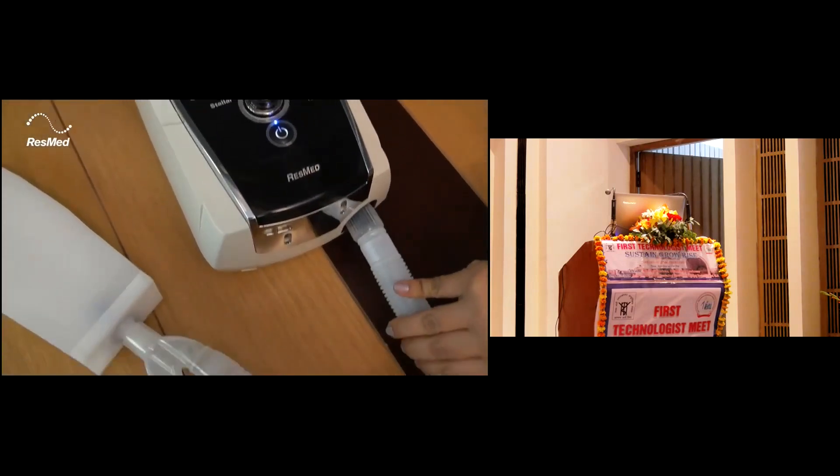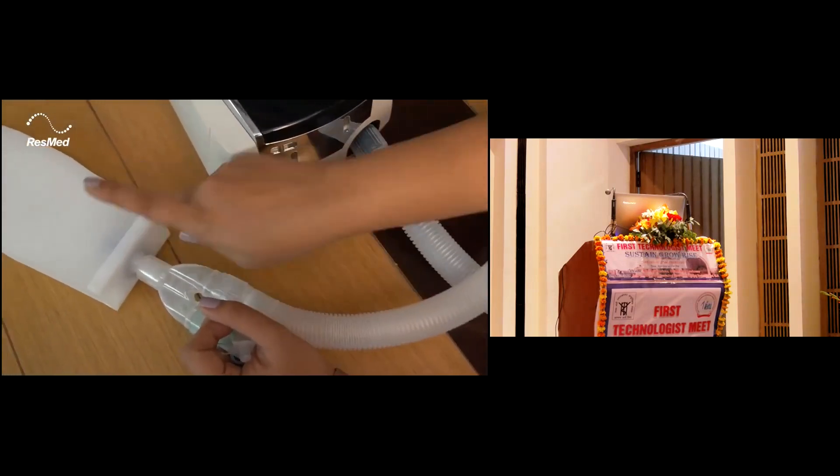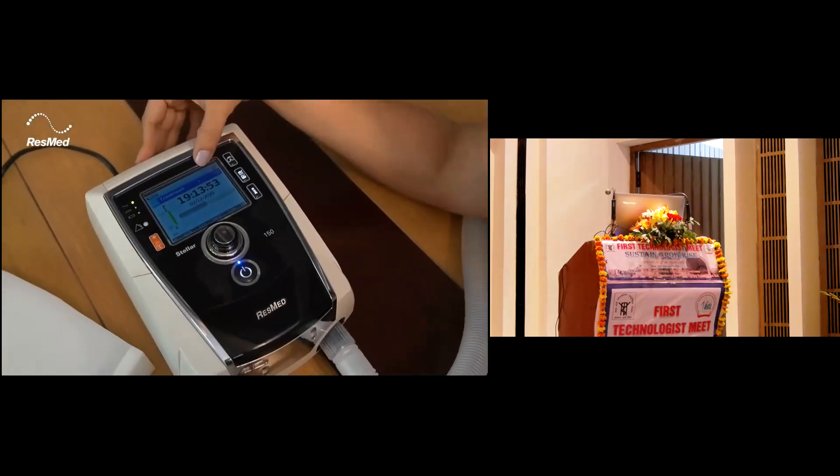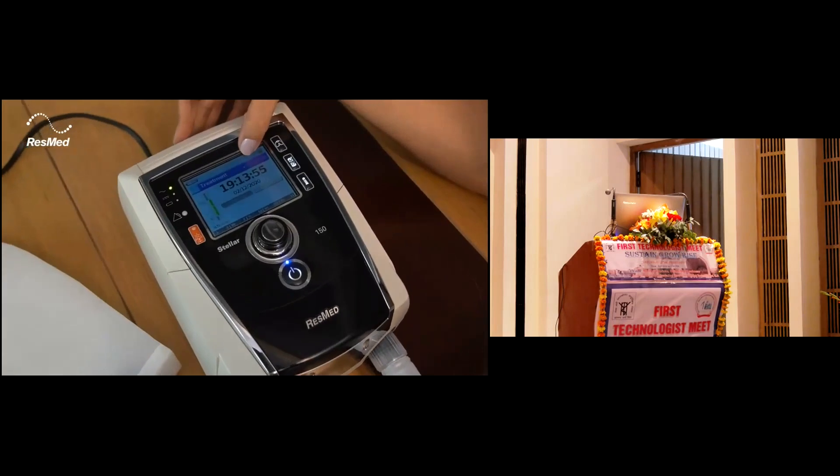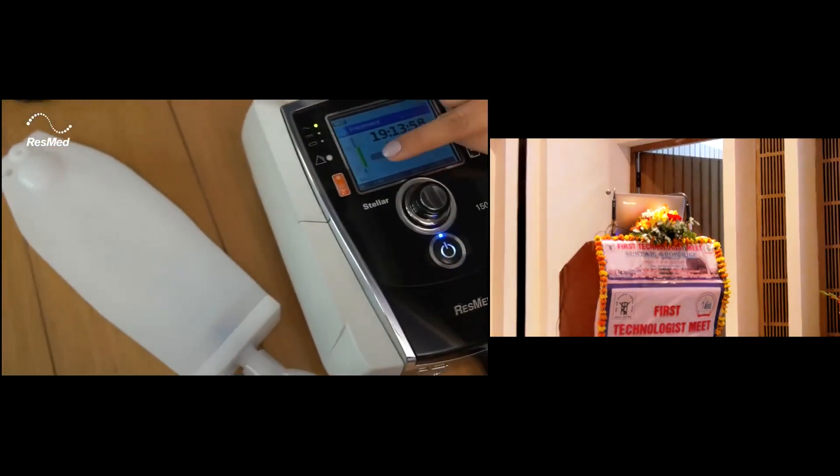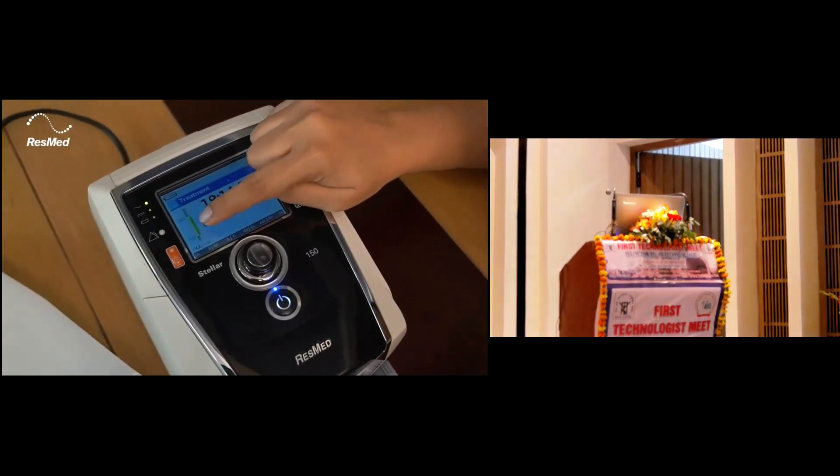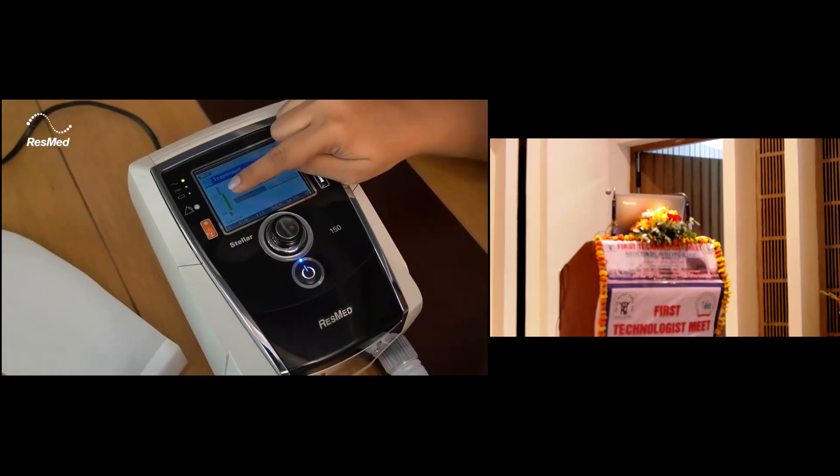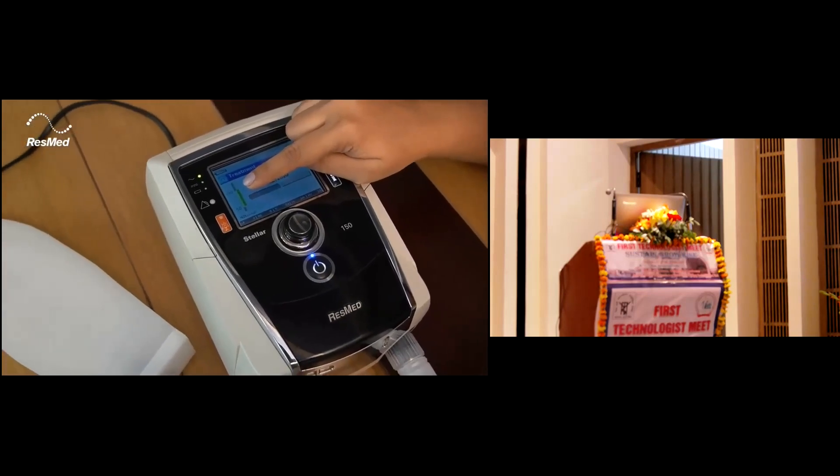Over here you can see I have connected a single limb ventilator to the test lung. We can see we had put the patient on program 1 and in the ST mode. As we had done the settings, you can see the pressure bar over here with EPAP of 5 and IPAP of 13 cm of water.